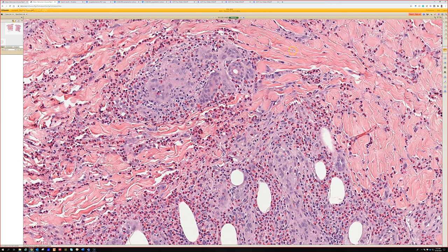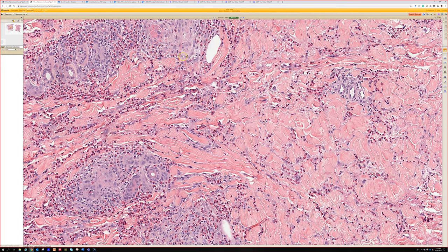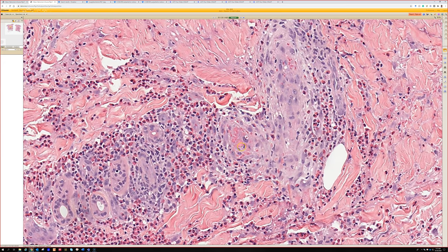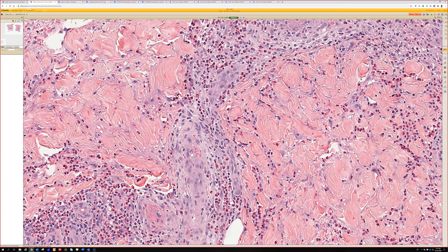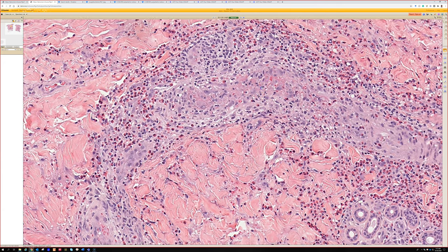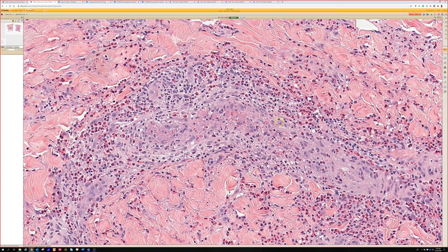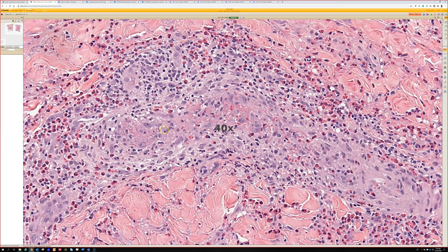I'm going to look more carefully to see if I can find vasculitis in that context. Over here, I think we are starting to see it — you can really see blood leaking through the vessel wall, some fibrin right here, fibrinoid necrosis, not a ton of neutrophils. When there's a lot of eosinophils, neutrophils and eos can mimic each other. This is a really damaged, torn-up vessel with endothelial swelling and fibrinoid necrosis of the vessel wall.